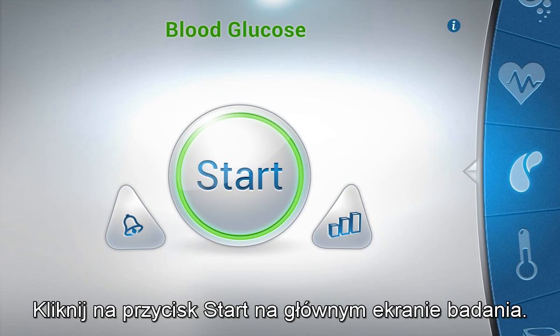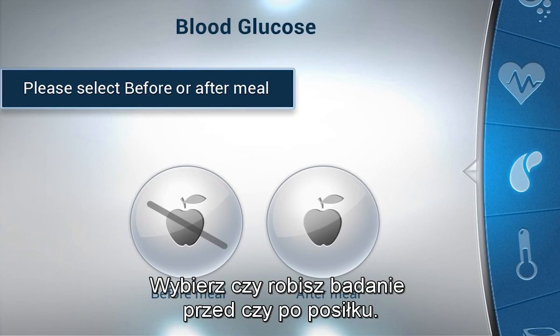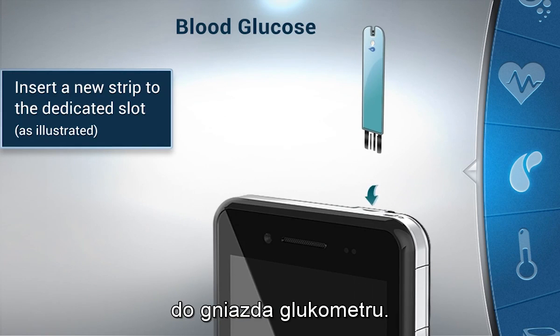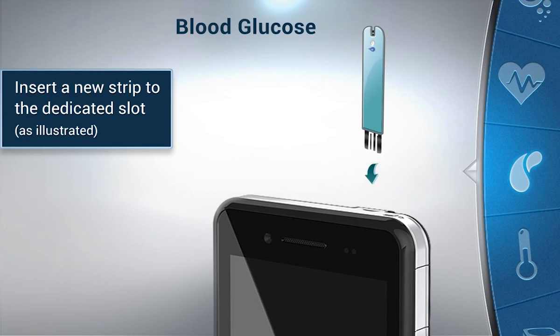Click on the Start button on the main test screen. Please specify whether you are before or after a meal. The device will instruct you to insert a new test strip into the device socket. Push the new test strip into your device until it stops.